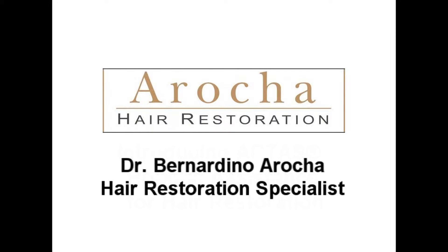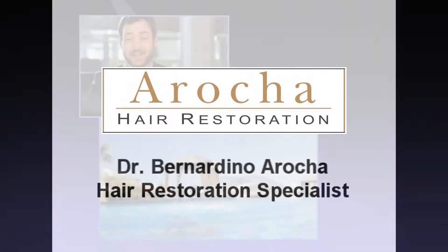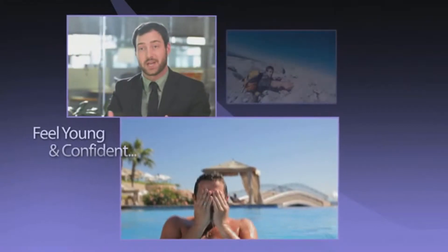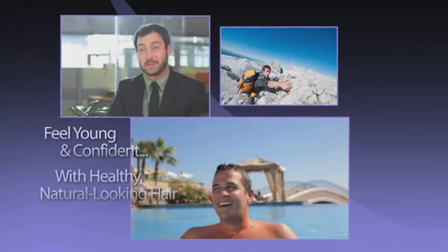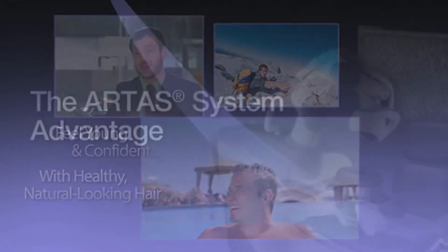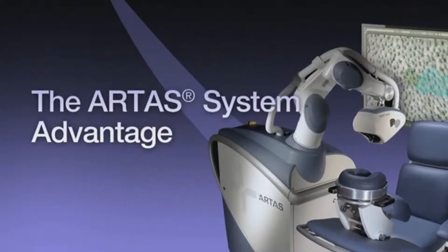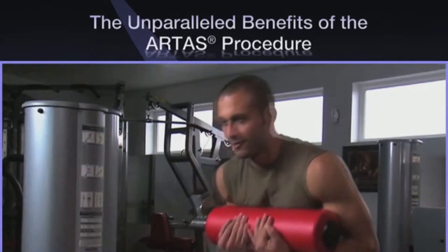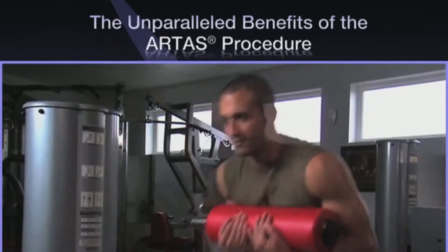The ARTAS System utilizes the latest digital imaging technology and precision robotics to help you keep that youthful and confident feeling with healthy, natural results. The ARTAS System is the first and only FDA-cleared computer-assisted technology for harvesting follicular units directly from your donor area.